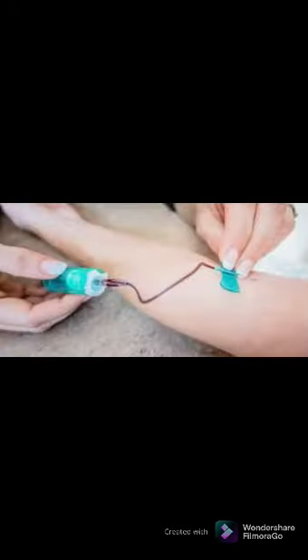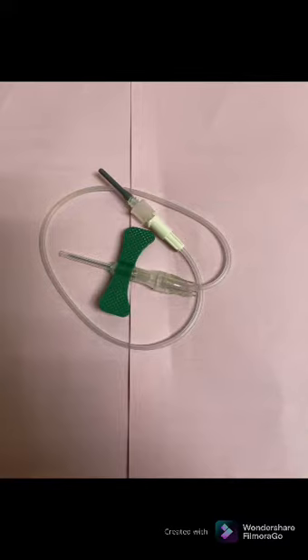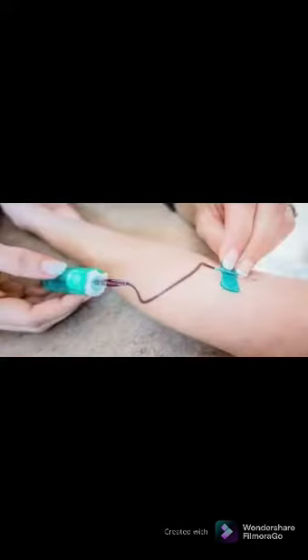Venipuncture procedure of hand vein with the use of a butterfly and ETS holder. Review and accession test requests. Approach, identify, and prepare patient. Verify diet restrictions and latex sensitivity. Sanitize your hands. Position patient hand, apply tourniquet, and ask patient to make a fist. Select vein, release the tourniquet, ask patient to relax hand. Clean and air dry the site. Prepare your equipment and put on your gloves.